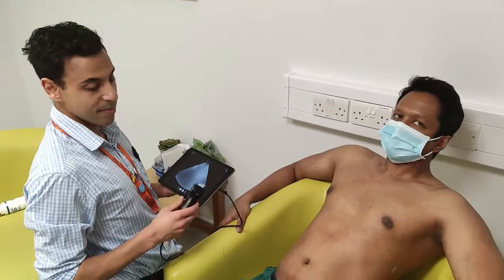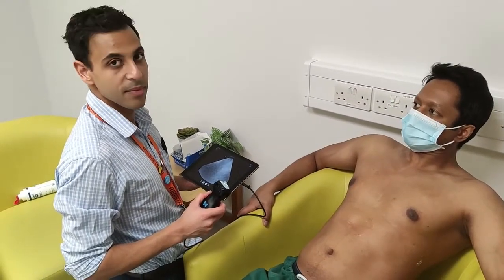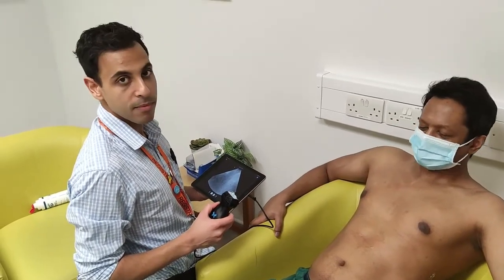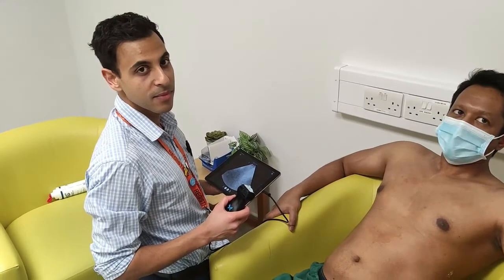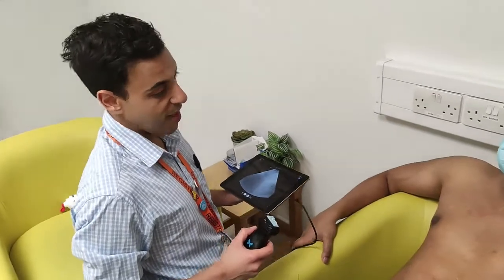So another common situation we're called to is a patient who says they haven't been peeing. And of course, one of the questions we're worried about is, is it because there's obstruction, or is it because in fact the patient's really dry? So Karen, talk us through how POCUS can help us in this situation. So again, POCUS can be extremely helpful in this situation.